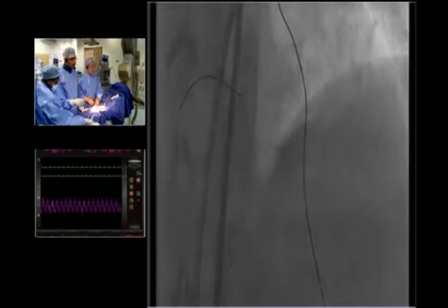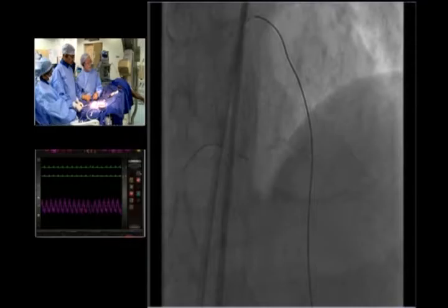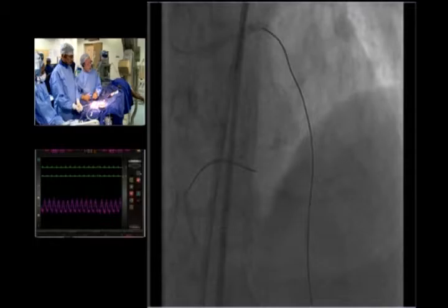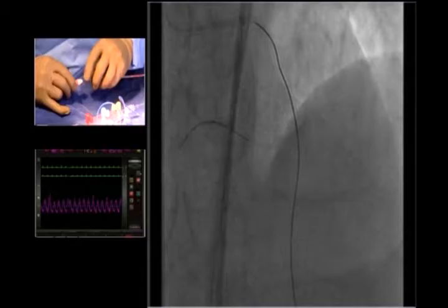So we can't hear Dr. Sharma. Very tightly trapped. Can I see the tip of the wire? No. Tip of the wire. You just want some extra support wire, whether Mailman, Grand Slam, or even any extra support, because the support of the wire probably is very weak. But I'm not sure whether at this moment I can exchange the wire. Yes, correct. Yeah, it's difficult, you know.